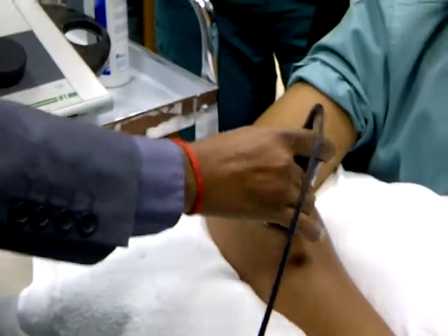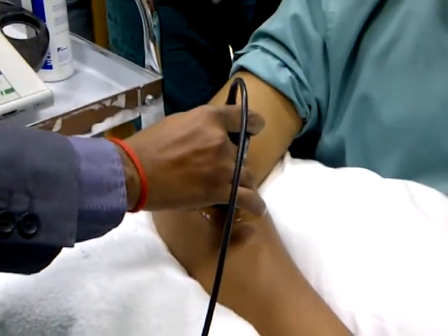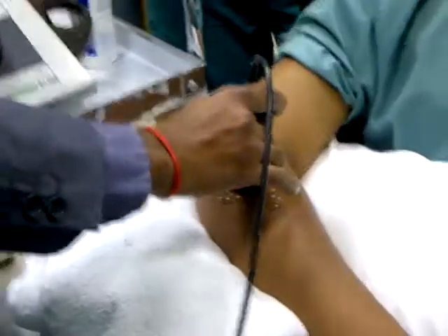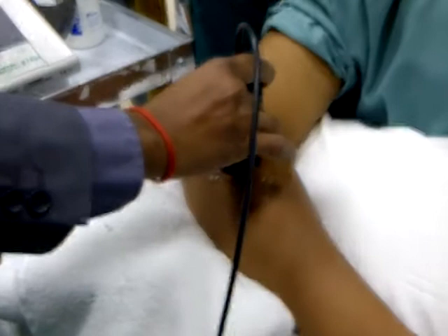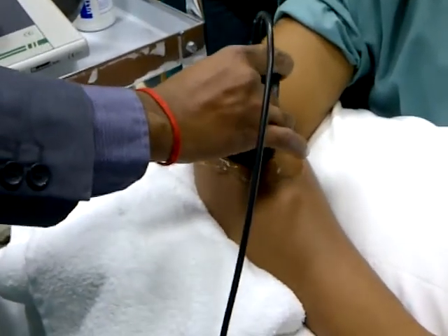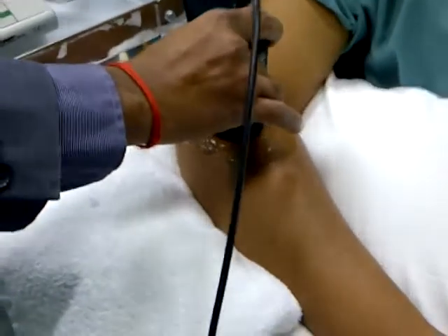If it is on the back or if there is more muscle, maybe you have to give some more gel. Okay, more gel, then there will not be any sound. But the area is small. If you give more and more gel, it will fall down. We'll just see the practical now. You just try to do it like this.